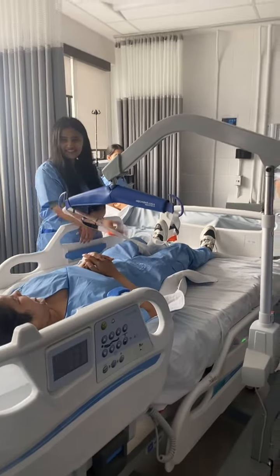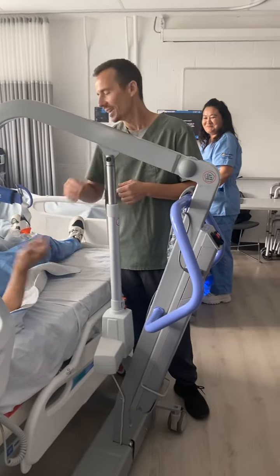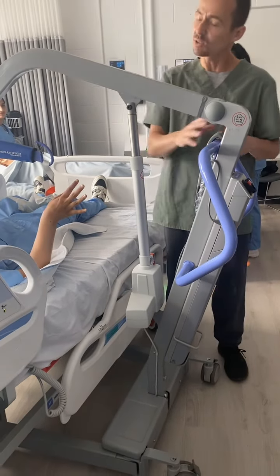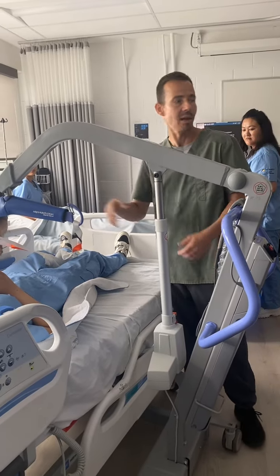It gives them control. It gives them independence, right? The patient needs to be quiet. Hey, we are trying to learn something. Then you're always talking. It's the first time that I work with you. I don't trust you yet. For today, I'm going to do it, but next day, I'm going to let you do it.